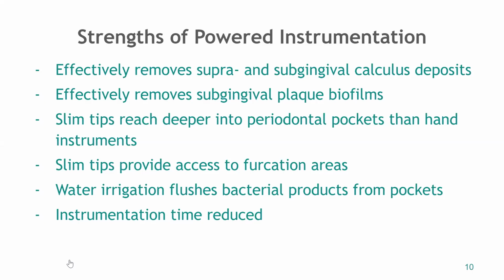Then definitely instrumentation time is reduced. So if you were to take, on a class 2 or 3, even sub and supra in the lower anteriors, it's going to take you a lot less time with the Cavitron than it would with your hand instruments, especially at the stage that you guys are at with your hand instrumentation right now.